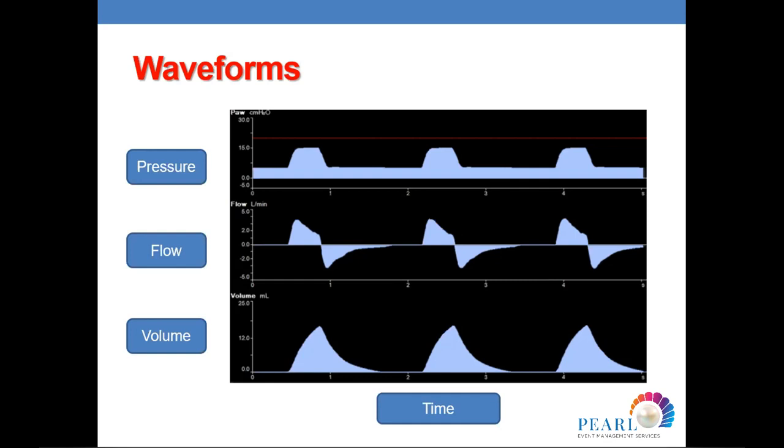The area under the curve in both means the inspiratory tidal volume or the expiratory tidal volume, and they should be equal. Then the volume will start at 0. Then at the time the inspiration stops, then expiration. So it is always positive.